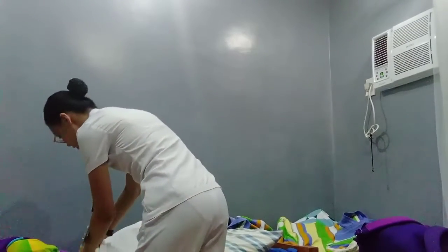If the skin shows bruising or inflammation, we need to use other sites. This is to avoid small blood vessels being accidentally damaged and leaking into the surrounding tissue. Okay, I don't see any bruising or inflammation. We can use this side.